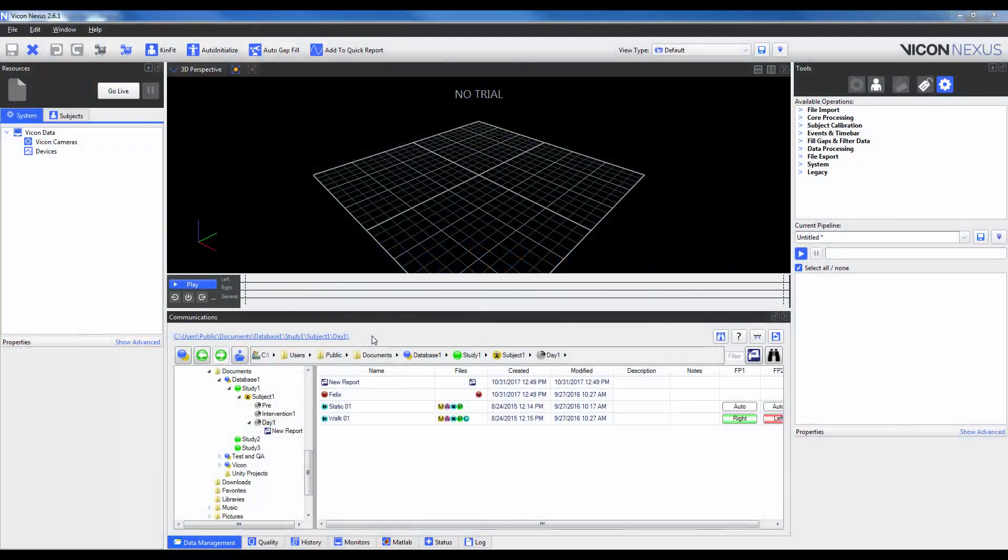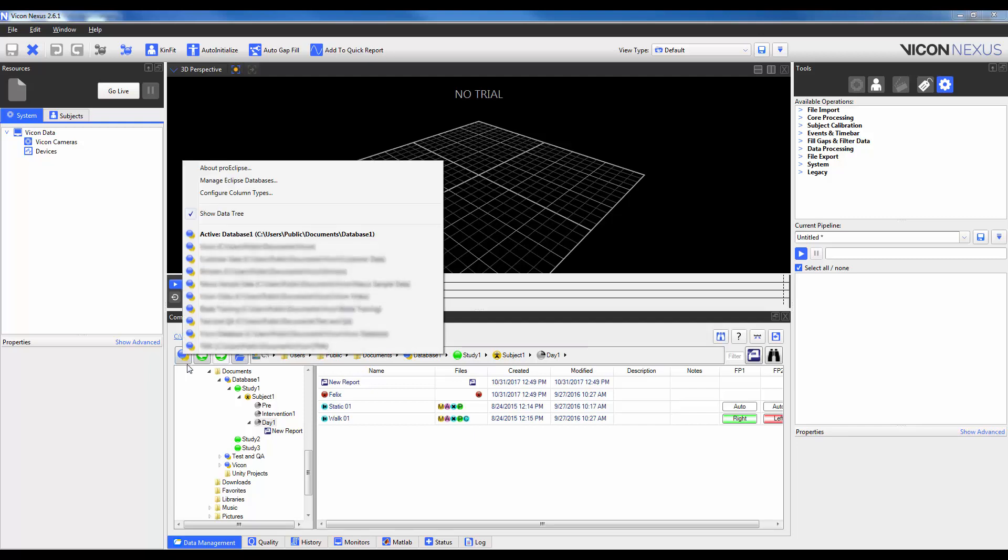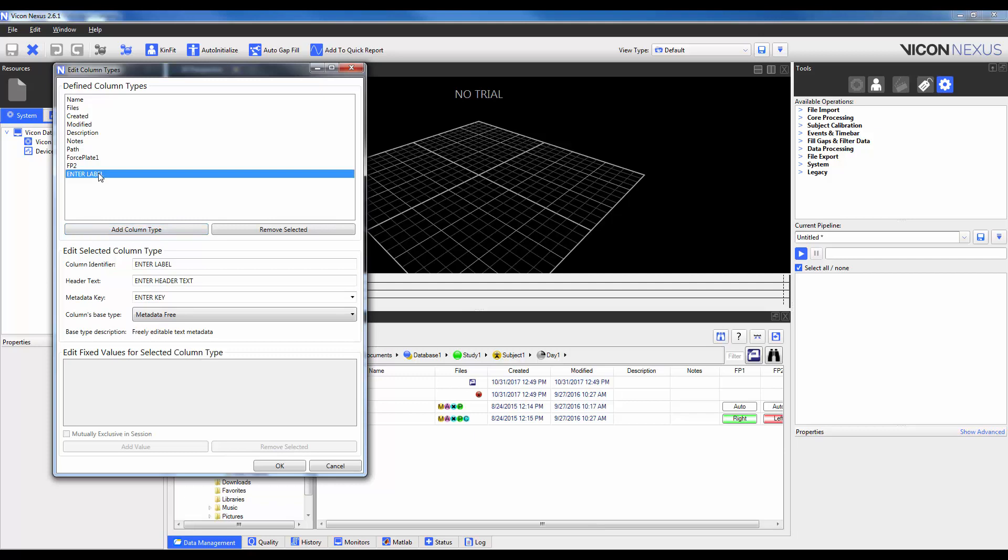If you would like to edit the Column Types that are available to be added to a Column Scheme, click on my ProEclipse menu and select Configure Column Types. Not only will you see a list of all available Column Types, but you can also add or remove a selected Column Type. So I'm going to add one here by clicking on the Add Column Type and then I'm going to highlight that Column Type.